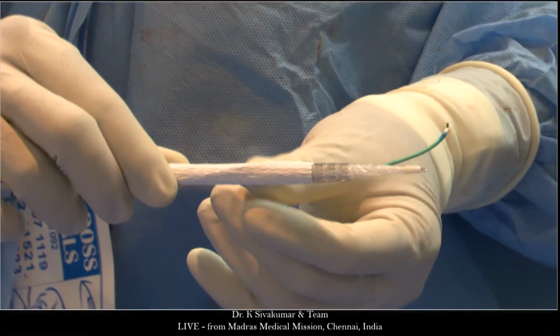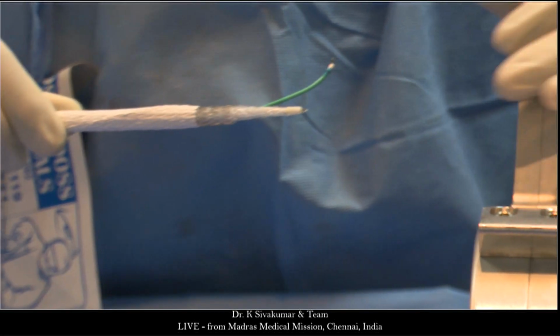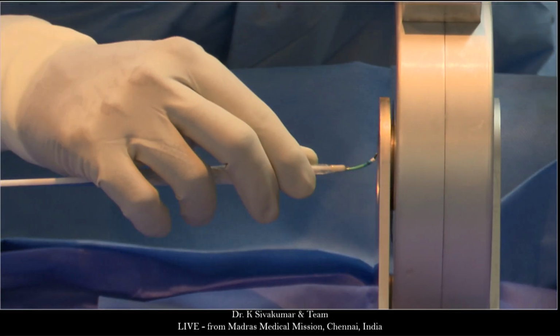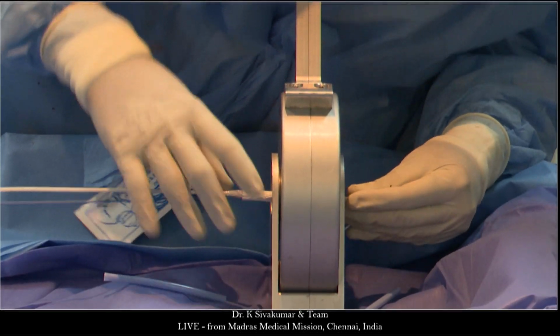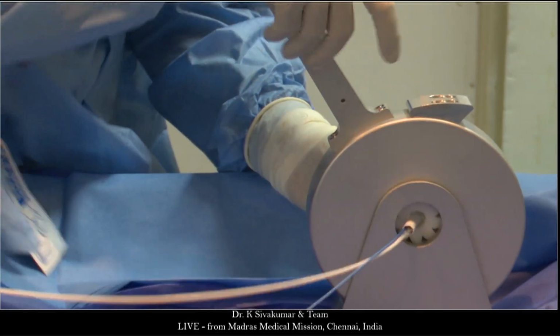So now I'm going to use a crimper. So this is the crimper. In this crimper, this is something similar to an Edwards crimper.